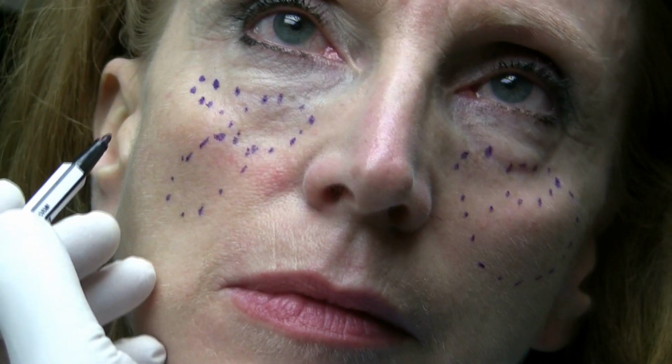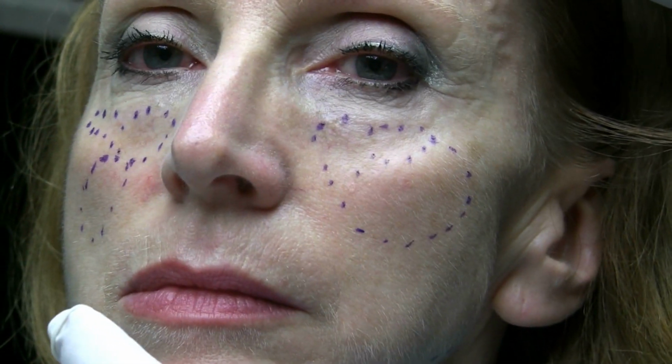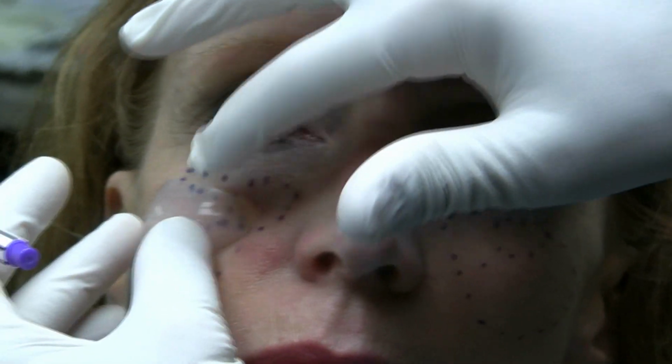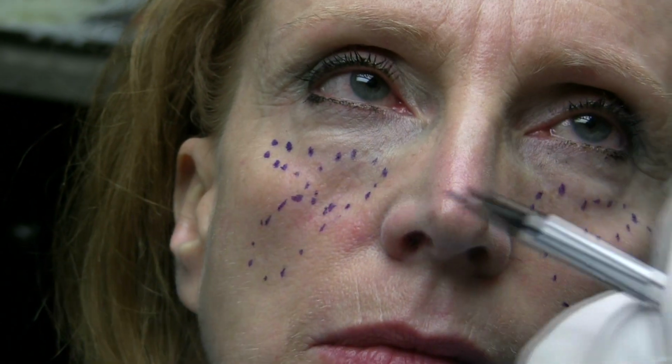I published an article in Dermatologic Surgery several years ago, "Give Me a Face Implant," about using a cheek implant as a template for filler. And this is a good area to illustrate this, where you can actually take an implant and trace it out on the face, and that gives you almost a perfect template of where to put that filler.